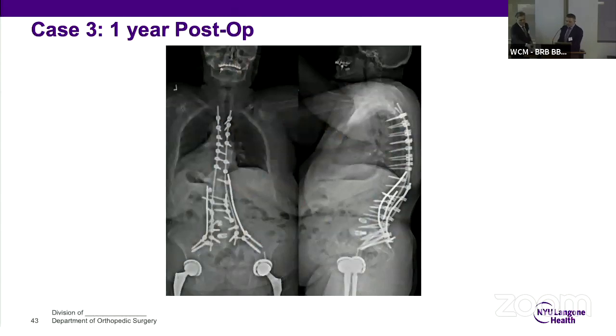Yeah, I tried to do, for something T4 to the pelvis, 2 acquisitions. So I find that you have fairly good accuracy T10 to the pelvis. What I do is I ask my radiologist to get me axial cuts with 1 millimeter cuts from T10 to the sciatic notches when I order a lumbar CT. They'll do that for me, and then I have all of that in one acquisition. So I'm not switching between 2 studies. And I'm going from T10, starting most distally.